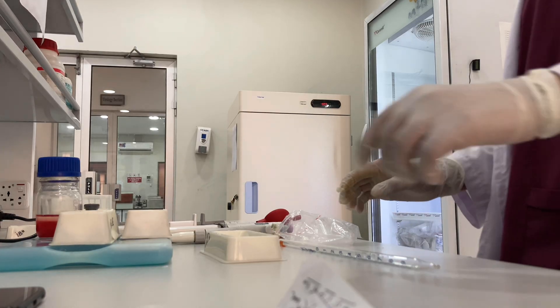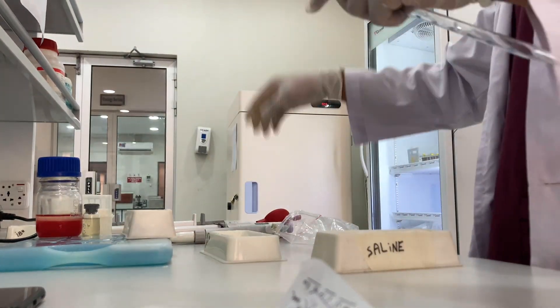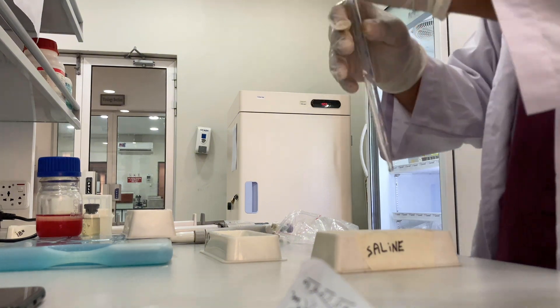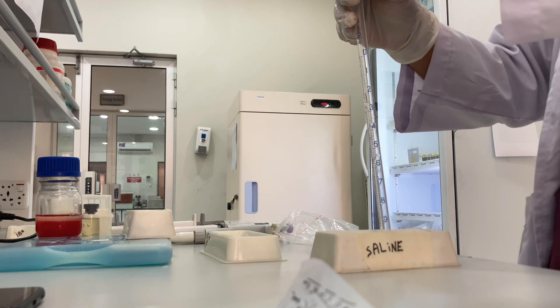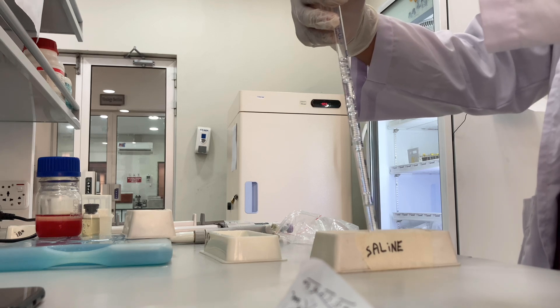According to your HA result, you have to prepare a virus dilution using saline and virus sample. Since my result was 7, I have to make a dilution with 8ml saline and 0.25ml virus. Mix it — this is how your working virus will be prepared.